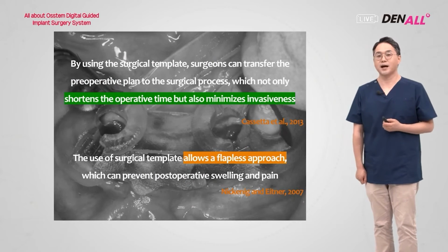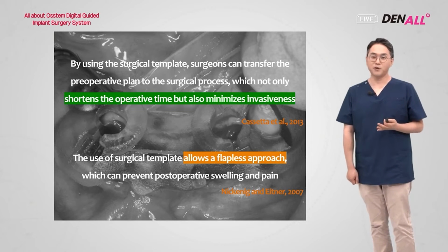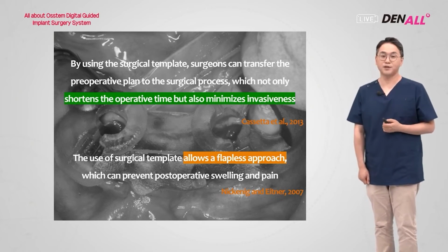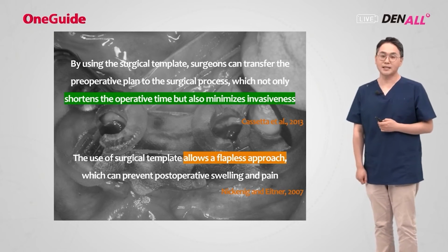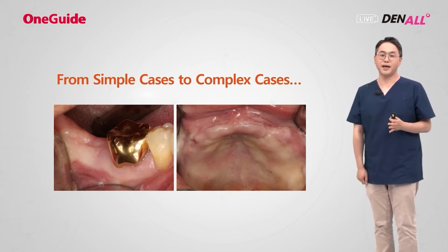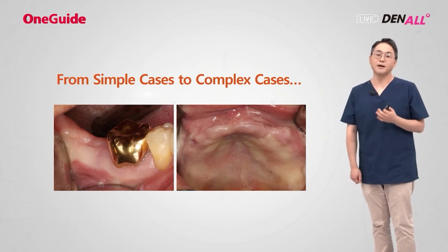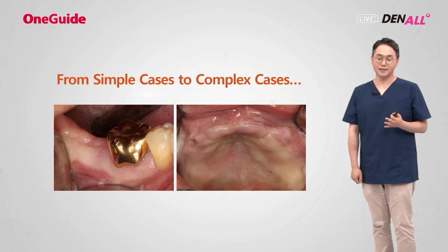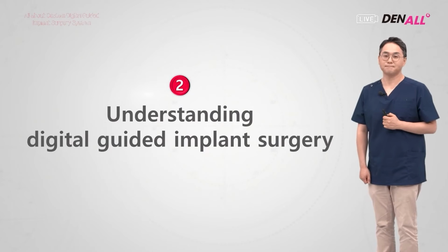From the patient's perspective, it is less invasive, so it's comfortable. Post-surgery discomfort is minimized. Flapless surgery in most cases is possible, so it's very good for the patient. The surgery time is reduced and it becomes less invasive. Digital guided surgery can be applied not only to simple cases, but to more complex cases like a full mouth implant case. I think it will be of great help regardless of whether you're a beginner or experienced.